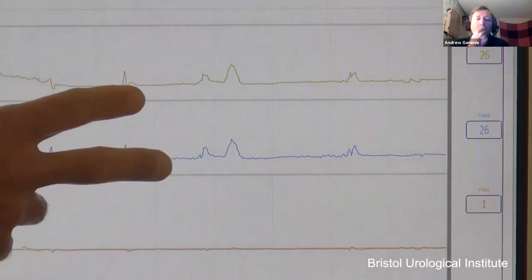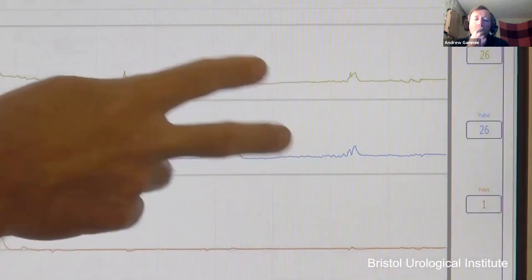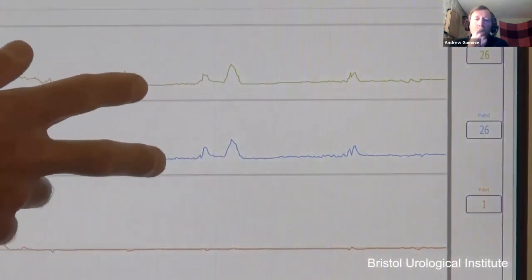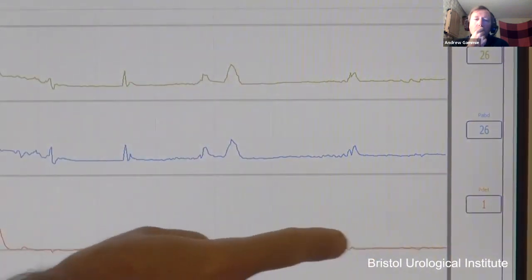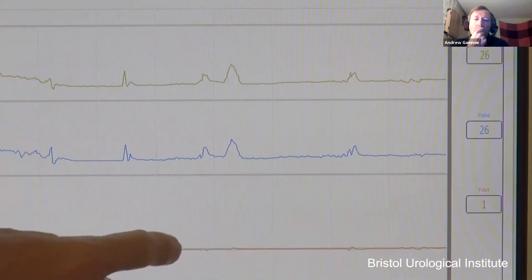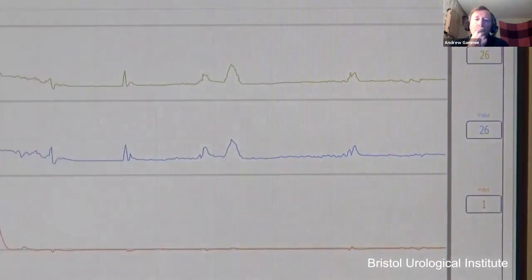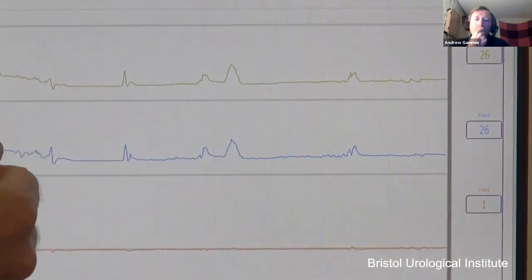Another quality check is the existence of live signal, these small variations in pressure as our patient breathes or talks. And you should be able to see slight movements on each line that are almost perfectly cancelled out on the PDET. That assures you that pressure is being picked up from the live patient. So that's your second quality check passed.